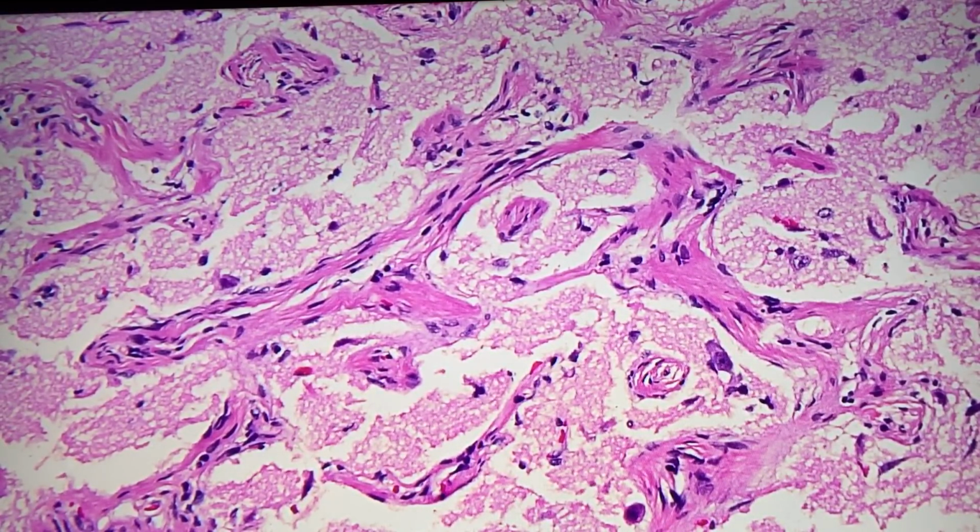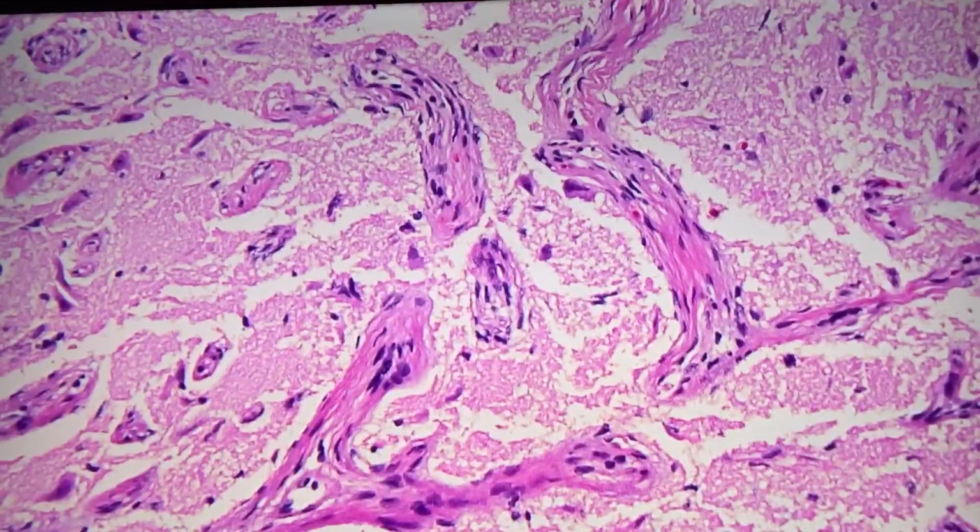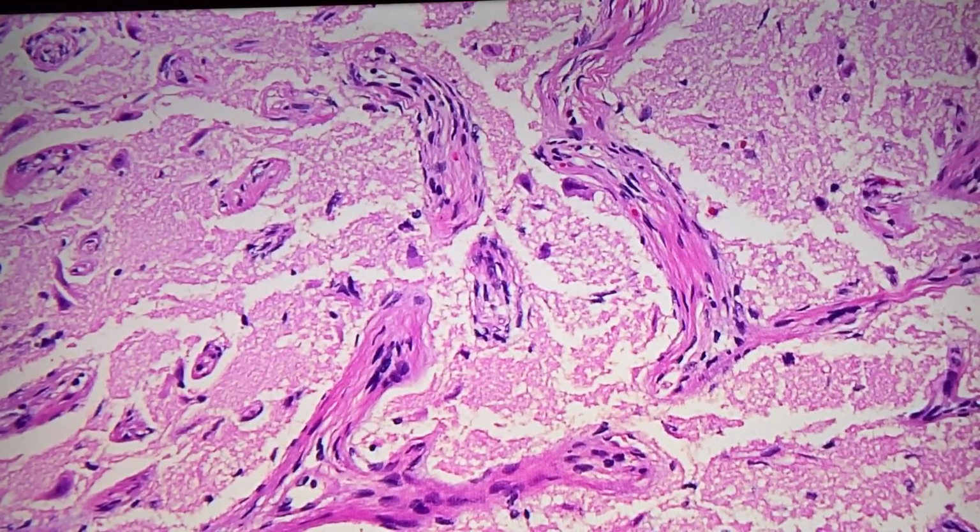So is your impression, Frida, that this is something neoplastic? Probably. I'm not sure. How about those spindly cells? Do they look overtly malignant? No. They're pretty bland, right? Very bland. What a great word bland is. It lets you say, I don't think this is malignant, without actually saying that it's not malignant. Bland. And in the tissue in between, you can see there are some neurons throughout.